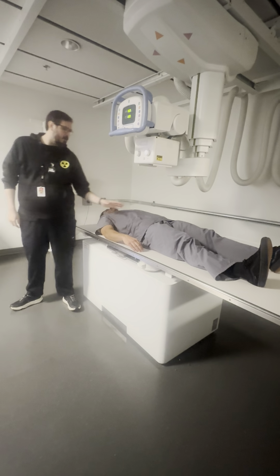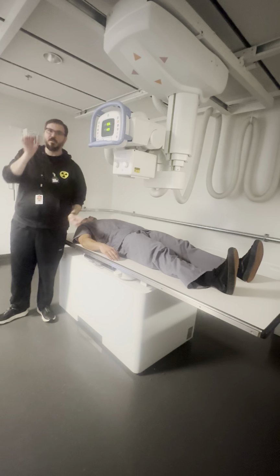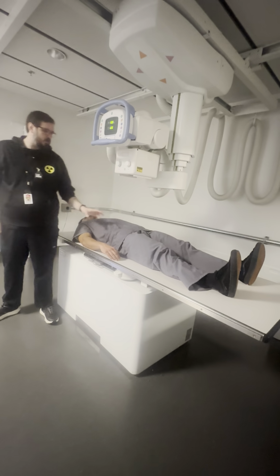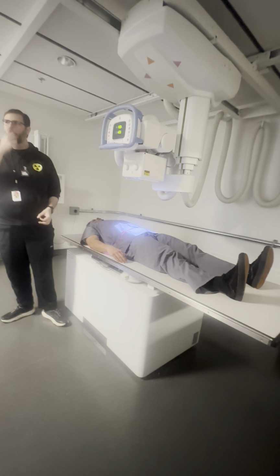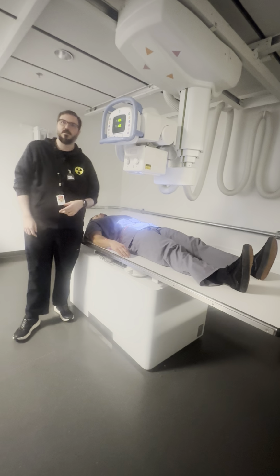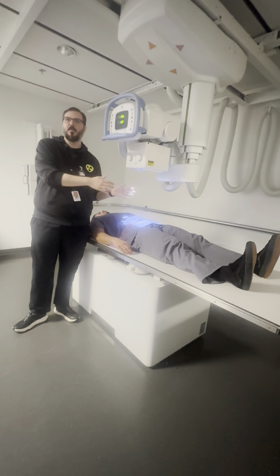I shoot again and I go, okay, now I have some good transit. It's in the jejunum. I'm starting to see it hit the ileum. Once I hit the ileum, that's when I go to my delay, because eventually I want to end up at the ileocecal. Is that on the right or left of the body? To the right, yeah. It's on the right, so it's down here, and it's really low, because then it's going to come back around in the large intestine. So when I see it going from jejunum to ileum, that's when I'm going to make my delay.